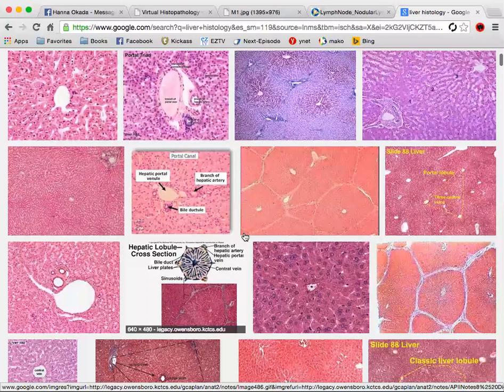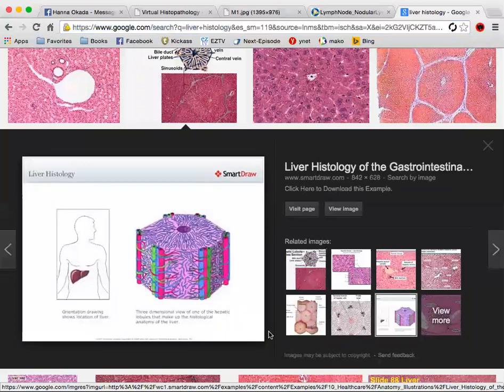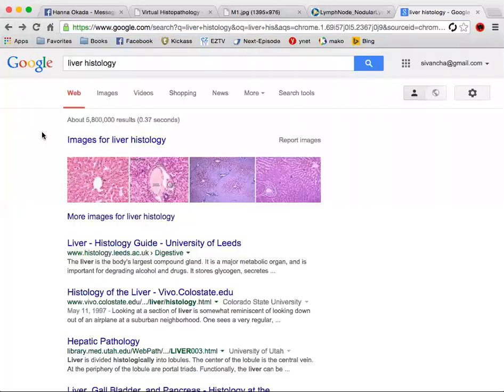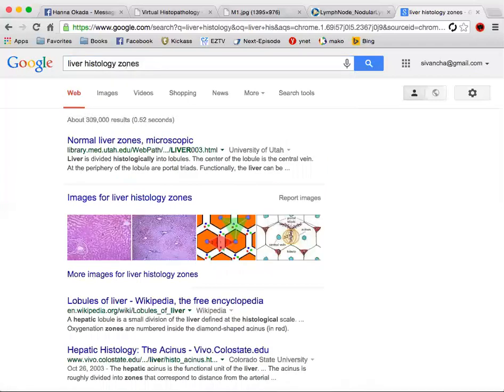So this is the normal. Yeah, because I want to show you the one with the zones.